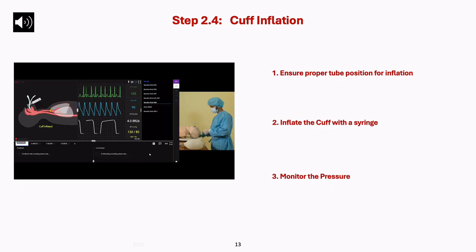Part 2, Step 2.4, Cuff inflation. First, we ensure the proper tube position, the position for inflating the cuff. Then, we inflate the cuff with a syringe, monitoring the pressure.